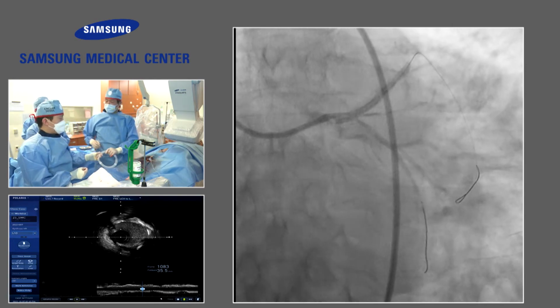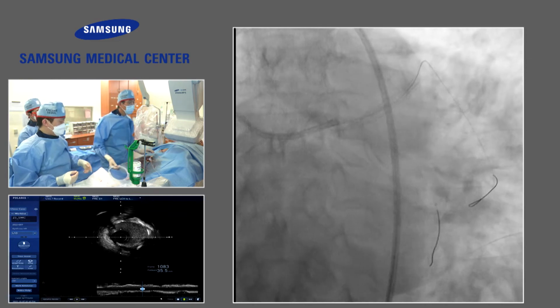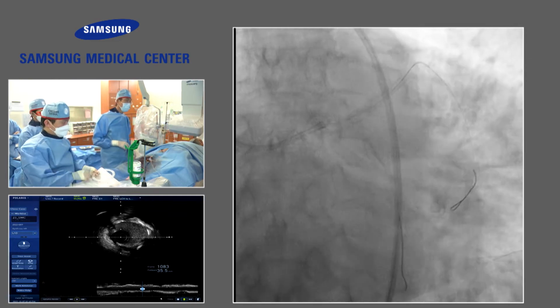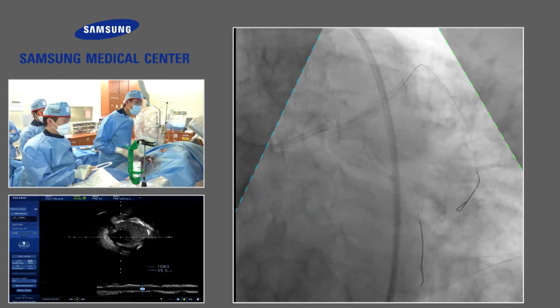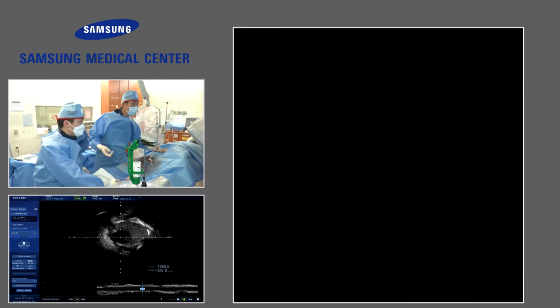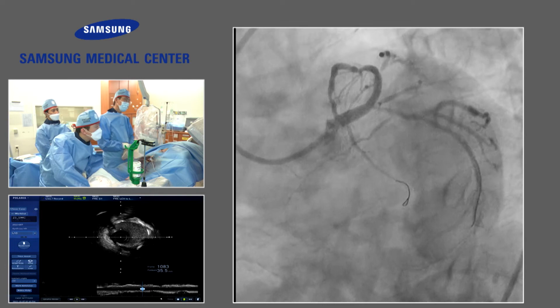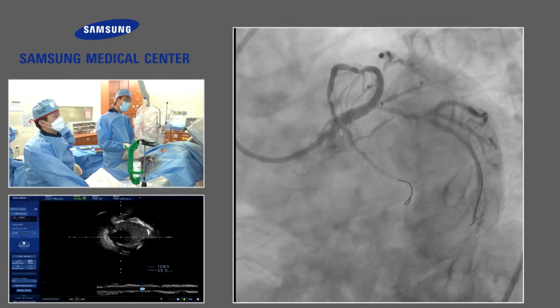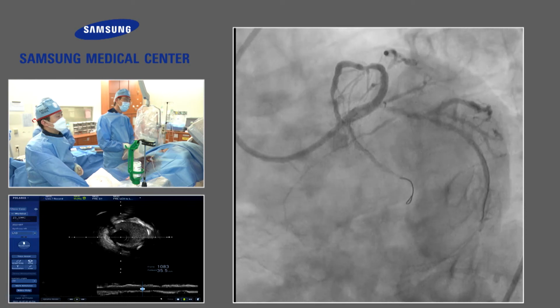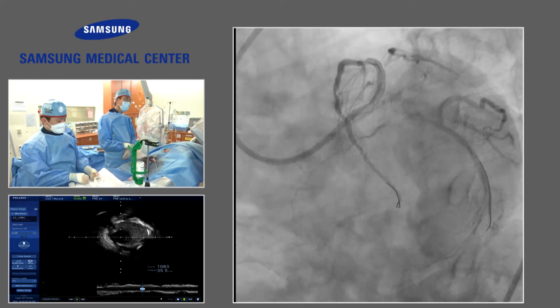Okay. But there are a lot of residual stenoses. Spider view? You created some dissection. No. The proximal circ, no, I don't think so. The ostium, just inflation. There is actually some haziness. Right. What about a stent? Retrospectively, just letting it alone is the best option. But I think I need a stent here.